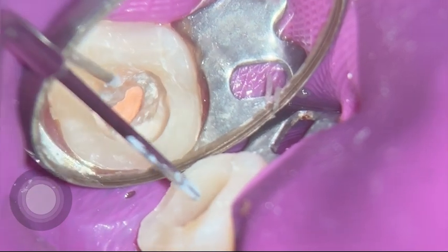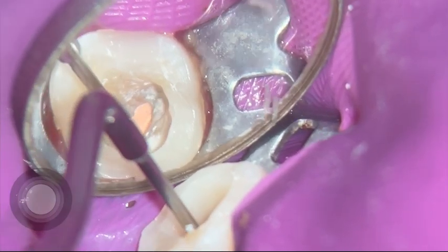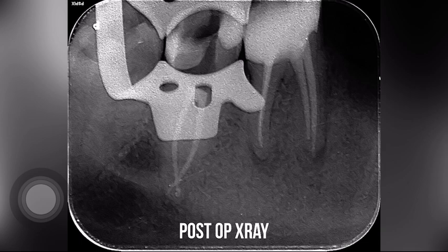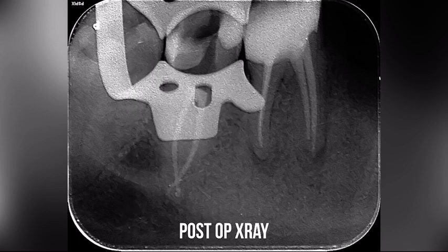With resin-based sealers, cleanup is a bit of a nightmare — that's one more thing I enjoy about the AH Plus Bioceramic Sealer. Everything looks very nice on the final x-ray. We've sealed all the way to the end, everything looks good, our pre-endo buildup looks good, and the patient will come back for a crown. I'm really happy with what I see, and the patient is happy too — everything went great.